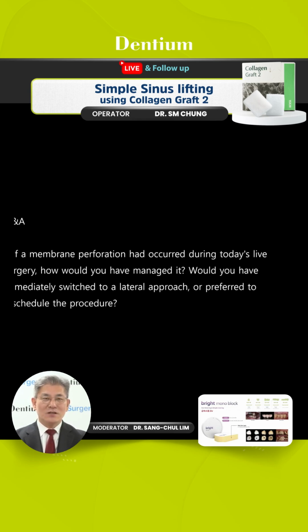At this time point, some surgeons want to use a collagen matrix to cover the small perforation area.